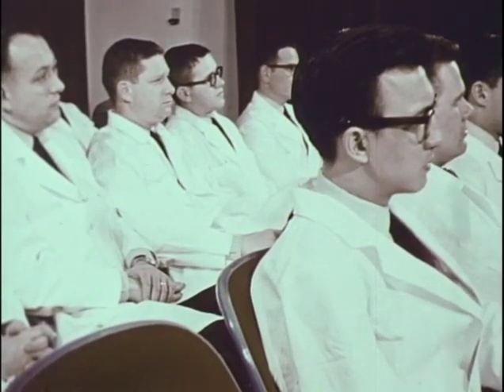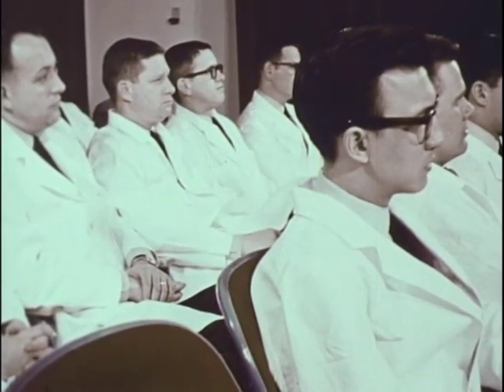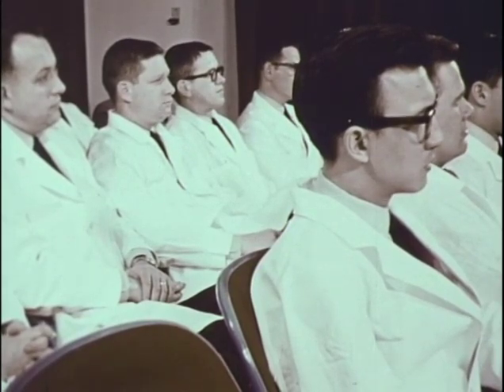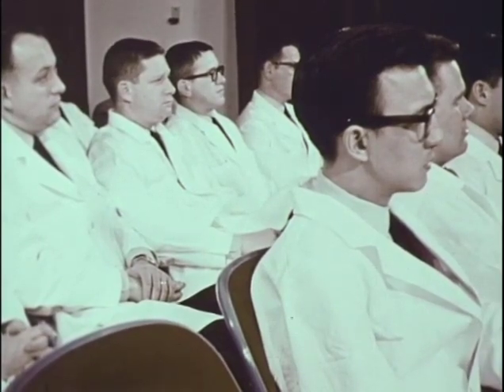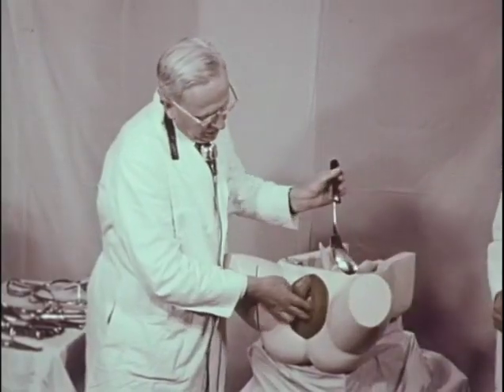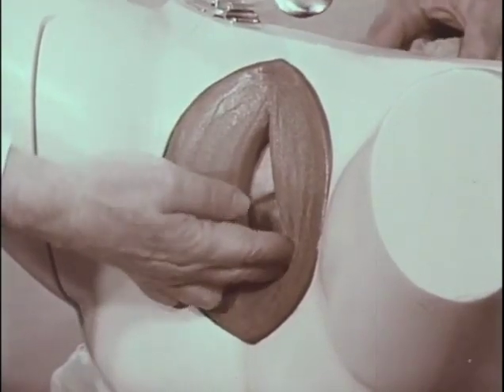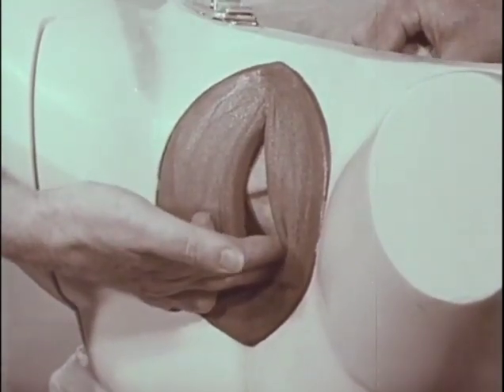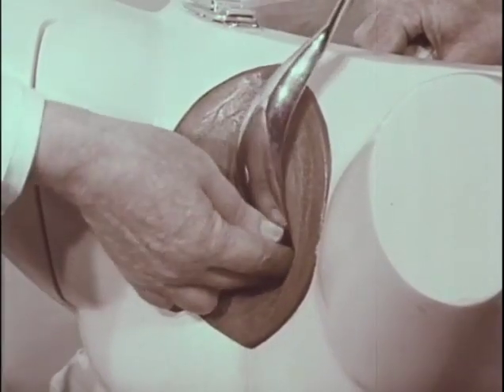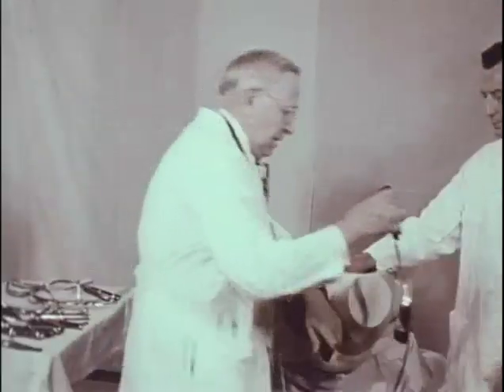Here we use the Elliott type of forceps because the overlapping shanks and short round cephalic curve take up less space and meet fewer points of resistance during the application. And the rotating fingers slip behind the posterior parietal bone, holding the head in the new transverse position, and the technique of application for transverse arrest is carried out.